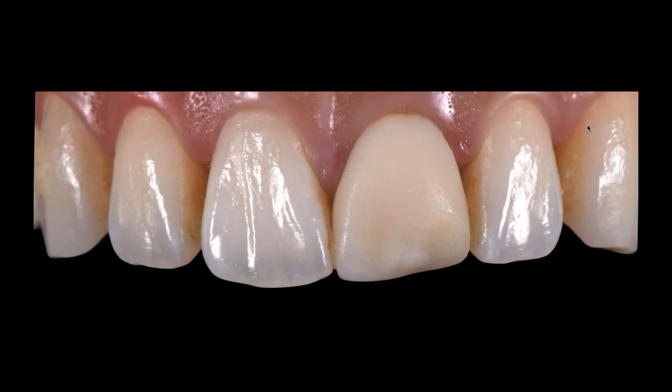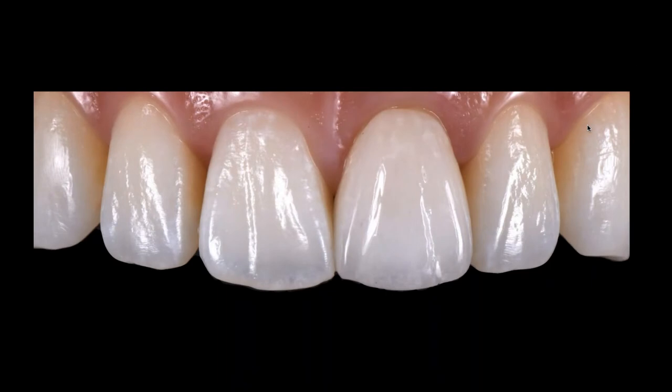And that's where the product and process part comes into play for me. So we'll make our zirconia coping. I'll do my layering on it. You can see my texture is a little weak on this one. I over-polished it, so bad on me. But I think in general, the basic parts of the tooth are there, the color and the value and all the little things that we need.